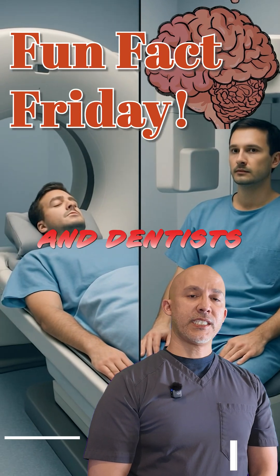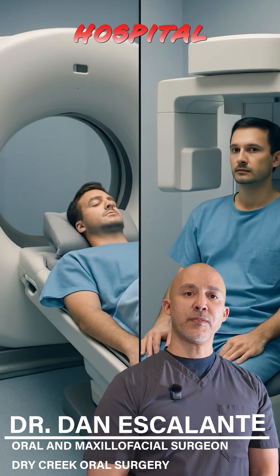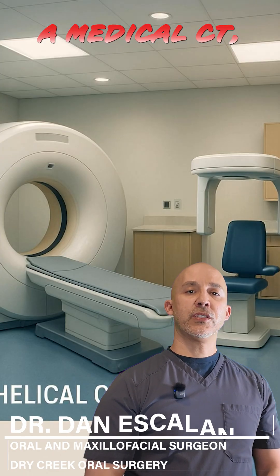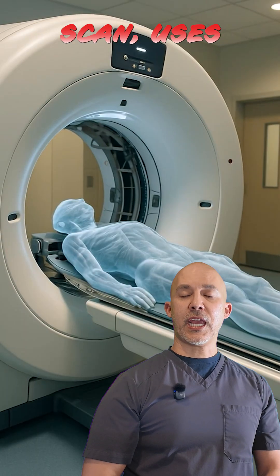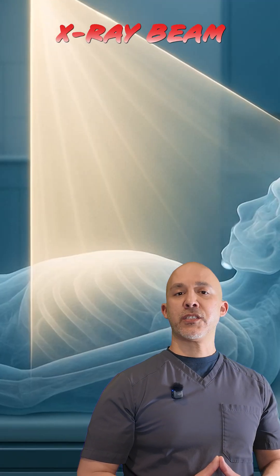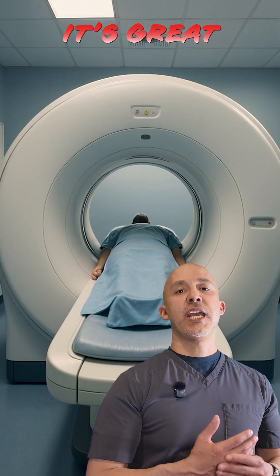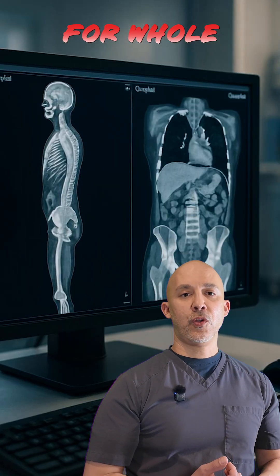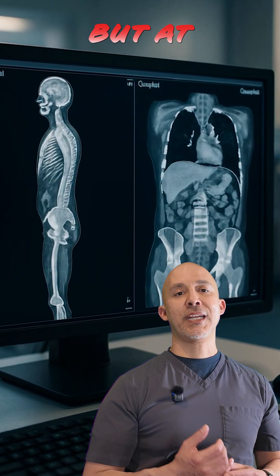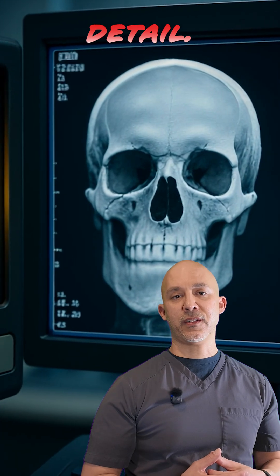Why do oral surgeons and dentists use cone beam CT instead of hospital CT scans? A medical CT, also called a helical scan, uses a fan-shaped x-ray beam as the patient moves through the machine. It's great for whole body and especially soft tissues, but at higher radiation and lower resolution detail.